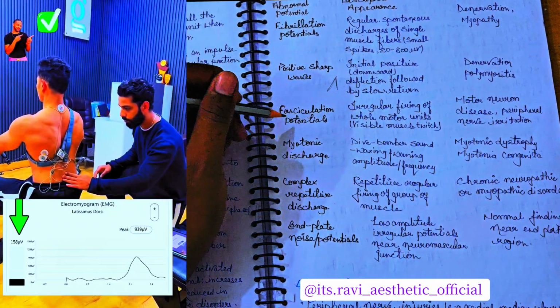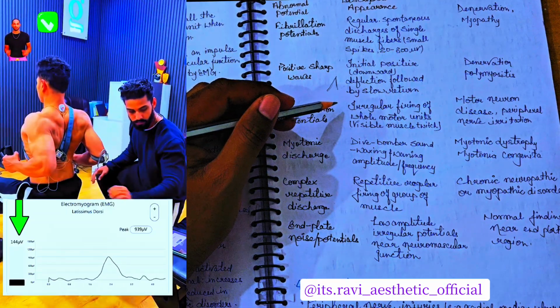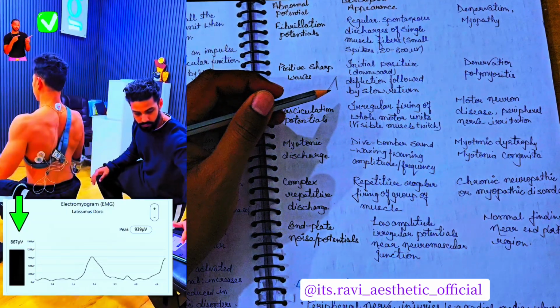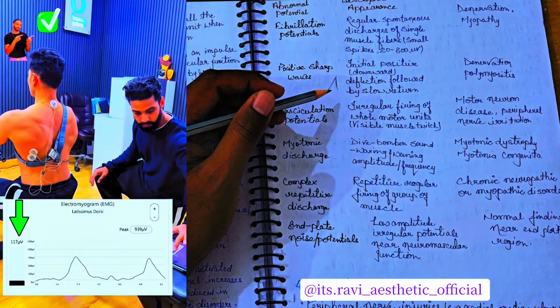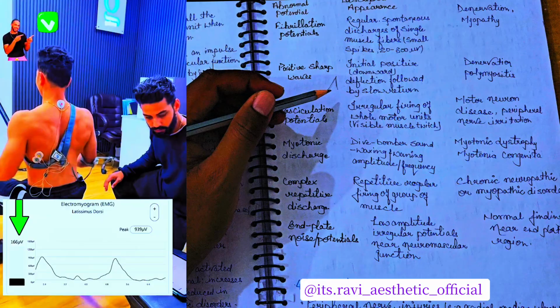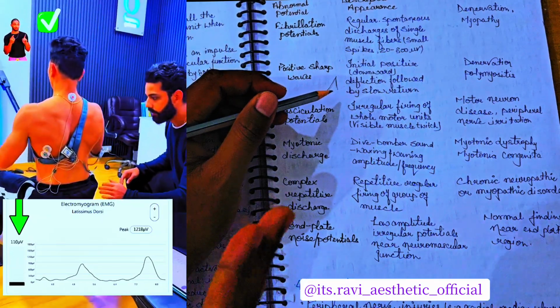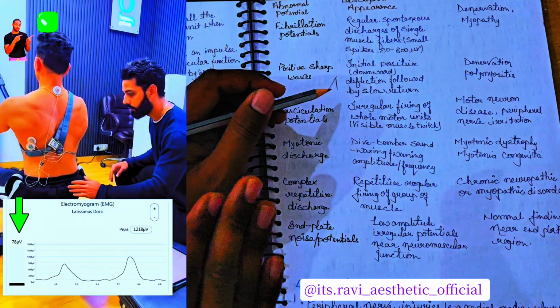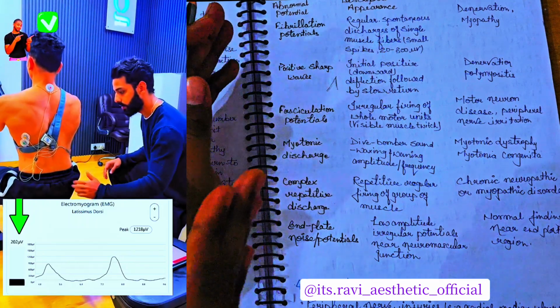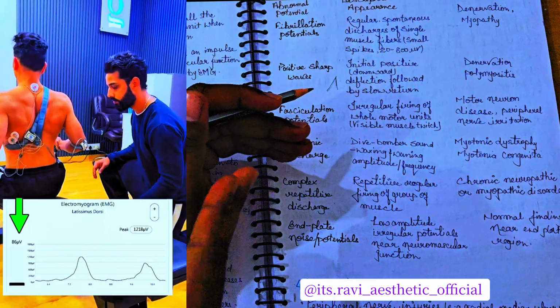So what is the fasciculation potential? It is irregular firing of the whole motor unit. It is visible muscle twitching. For example, when we follow the protocol of dry needling and insert the needle into the body, the muscle twitches. The firing rate comes from the CNS; sometimes it comes, sometimes it does not.